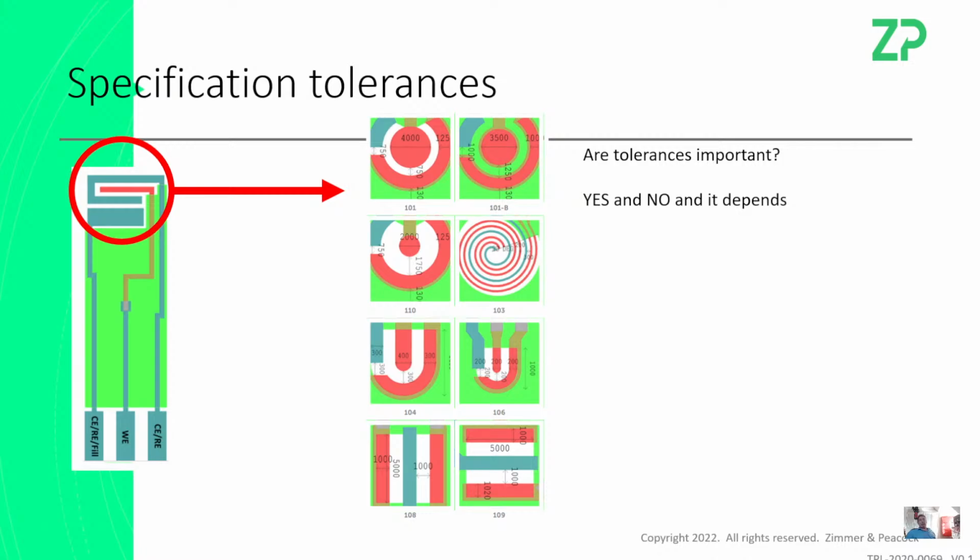As you do amperometric measurements, then yeah, they do become more important. But when you talk about the variabilities in a biosensor, you have the underlying electrode, then you have the enzyme layers, then you have the microfluidics on top of that. There's a lot of places to have variability in your manufacturing. And so you have to think of it holistically.